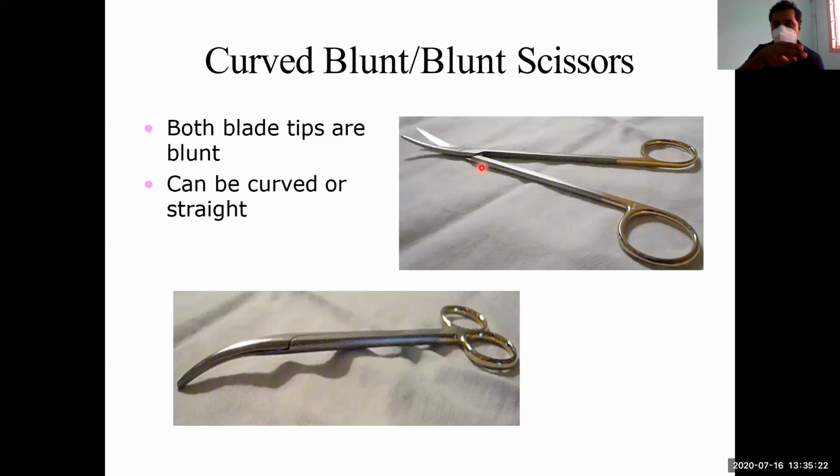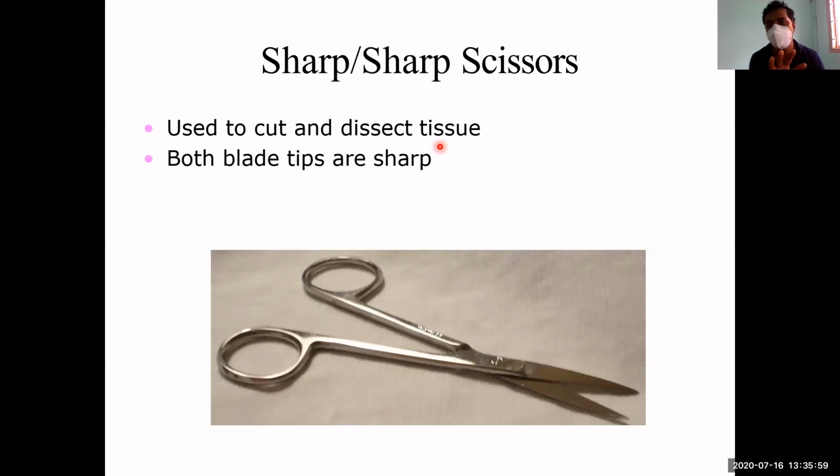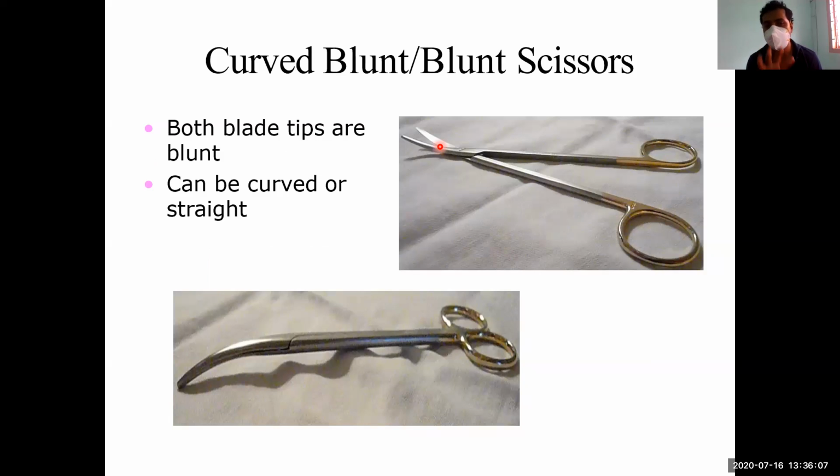Now, if we use the straight scissor, my vision of the structure in front will be hampered. But if we use the curved scissor, then my vision is directed to this area, so I can see and cut. So it is easier to use the curved scissors in the deeper part to see and cut. But with the straight one it will be difficult, as the scissor itself is blocking my vision. So the straight scissors we mostly use for cutting superficial tissues, and the curved scissors we mostly use in the deeper part to cut anything deep. Yeah. This is the main difference, and controlling is also better.